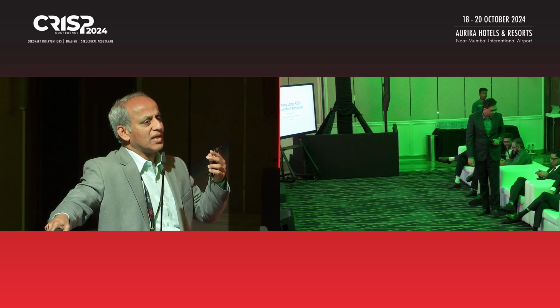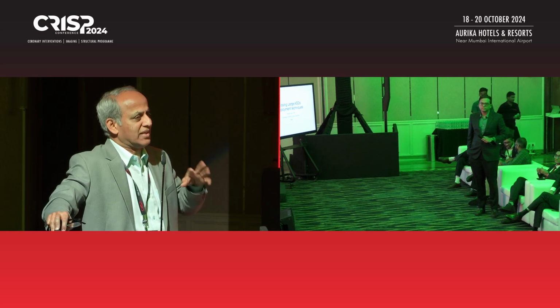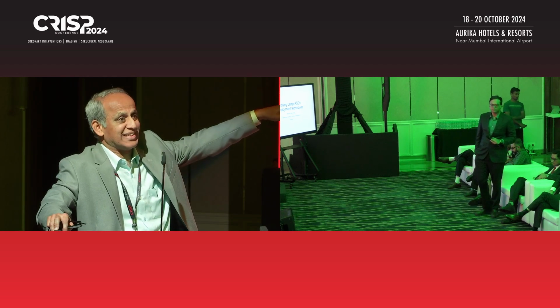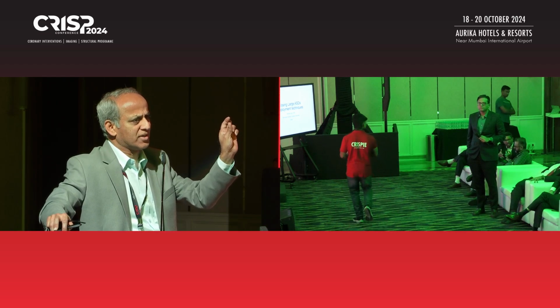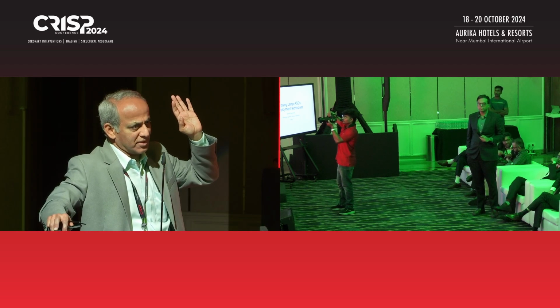Sizing-wise, we end up oversizing very often. Four millimeter oversizing to me is pretty much the norm in our lab. And when you have the really large ones, especially the failed one I showed you, it looked like just 10 millimeters on measurement, and a 16 millimeter device kept going down. So you are okay to go up to 6 millimeters more.